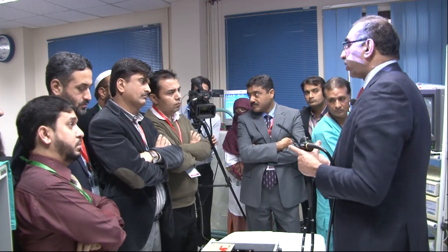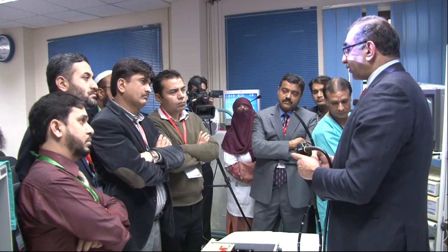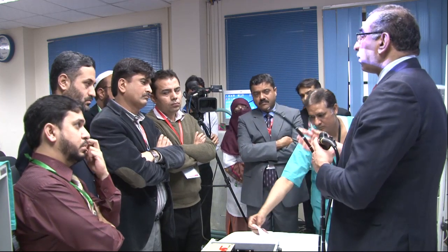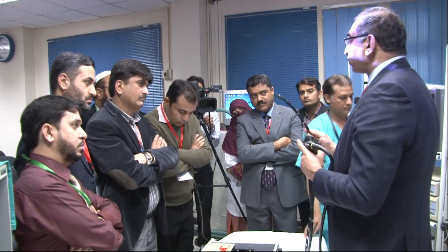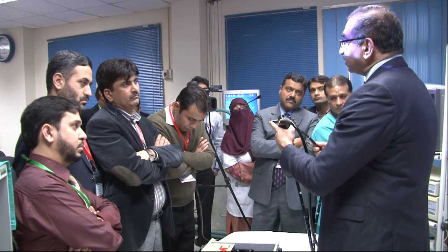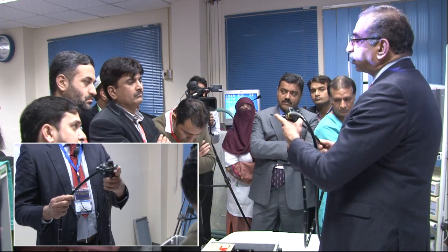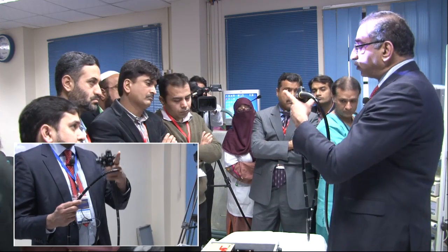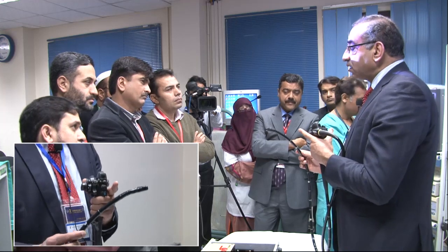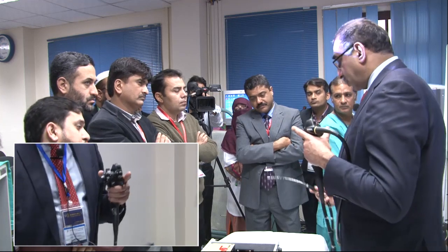So rather than start twiddling the knobs, I just ask them to keep it on a gentle curve, pass it over the tongue and to the back of the scope like that, and the scope will go down usually very easily, much easier than the gastroscope because it's got a rounded end. A gastroscope is cut off like that, so it's more difficult. It's easier to intubate. You just have to be gentle and careful, right?